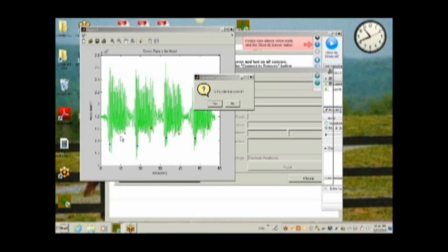The default for selection is 10%, meaning that all strides that fall within 10% of the median stride rate will be included for analysis. This percentage was determined to be the most accurate for including regular trotting strides and not including non-trotting strides. In this example, data will be analyzed from here to here, here to here, here to here, and here to here. And notice when the horse is stopping and turning around, those strides were not selected for analysis.